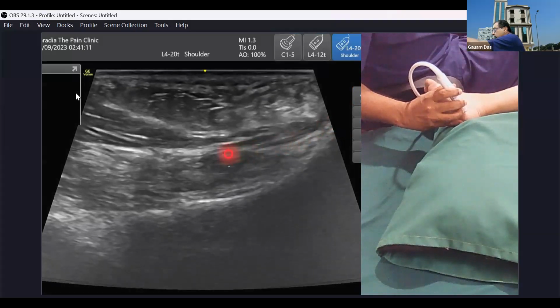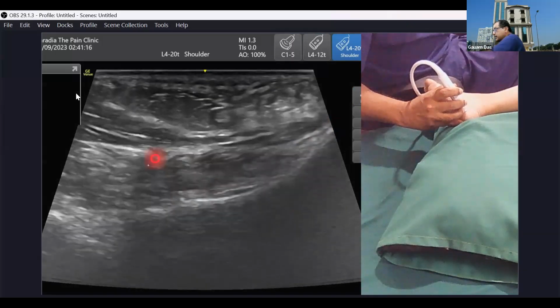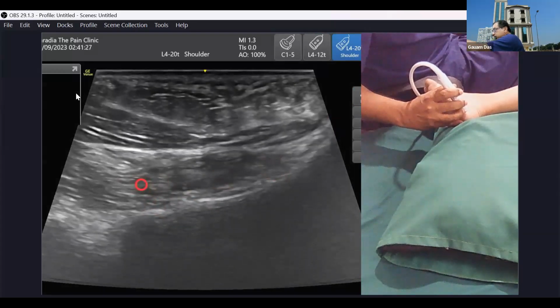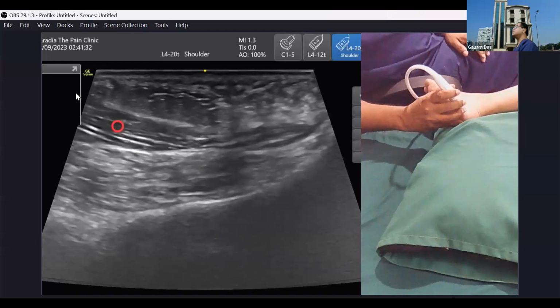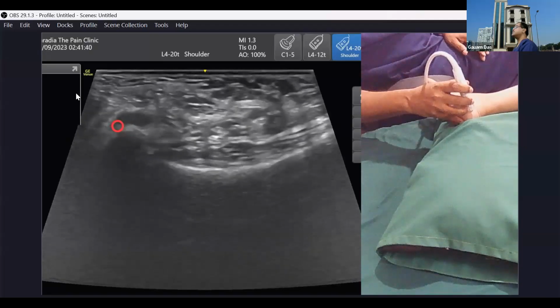And these are the two other nerves. One nerve, lateral plantar, and this is the medial plantar. And this muscle is your quadratus plantar. This muscle is the abductor hallucis. So now just follow these nerves. And if I'm going more towards your abductor hallucis.